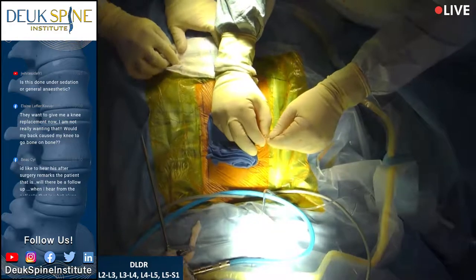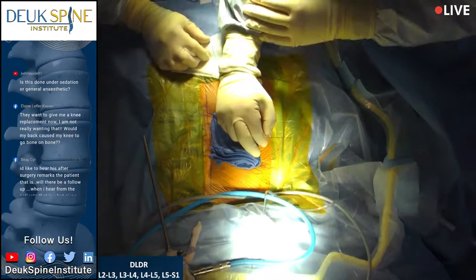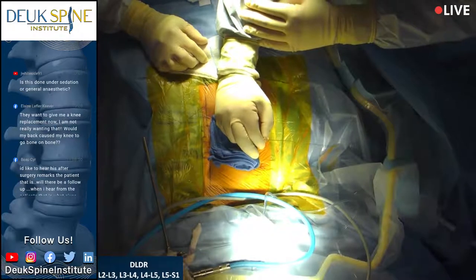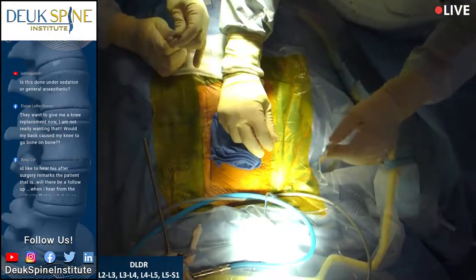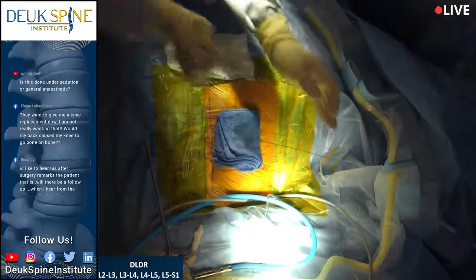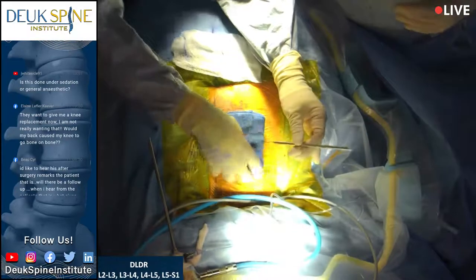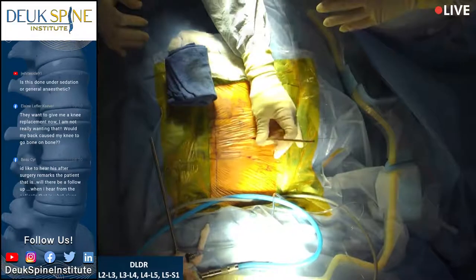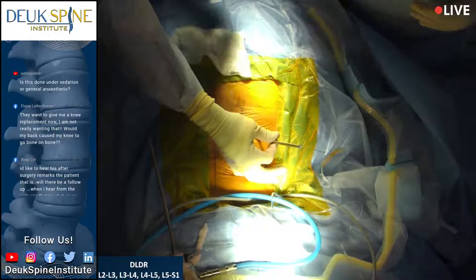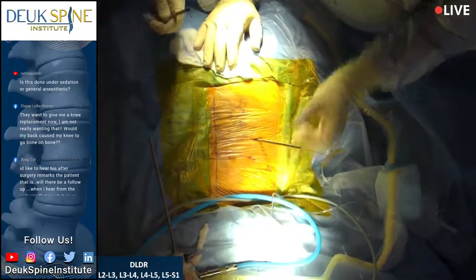And there are going to be times when he's not comfortable. All right, I'm just making sure my guide wire is there. And so if he's more uncomfortable, we're going to give him a little more of the sedation. And if he's comfortable, we're going to keep him there. It's like juggling for the anesthesiologist. They want to keep the patient comfortable by making him sleepy enough, but they don't want the patient to stop breathing or aspirate. So it's a balancing act, and it takes a really good anesthesiologist to do it right.